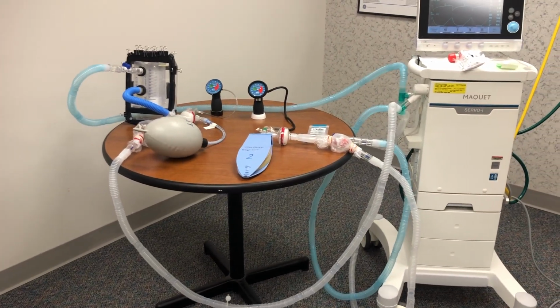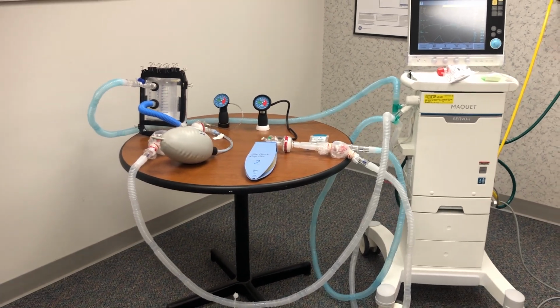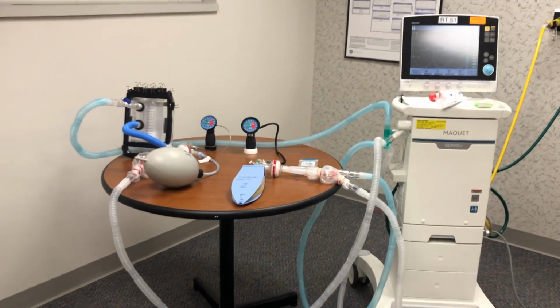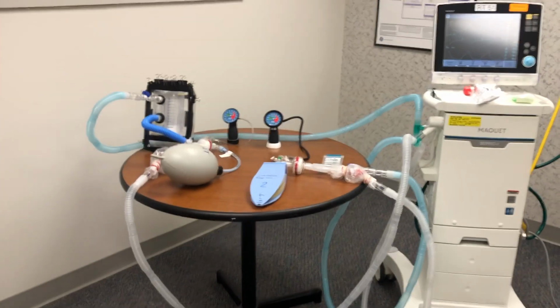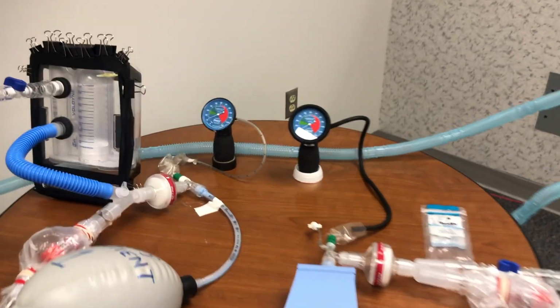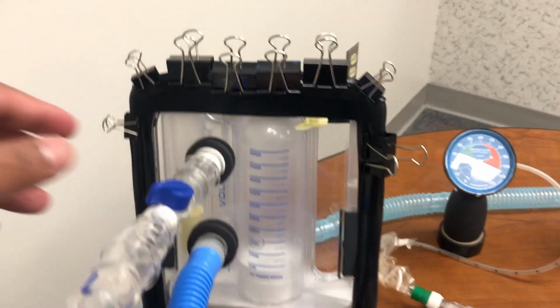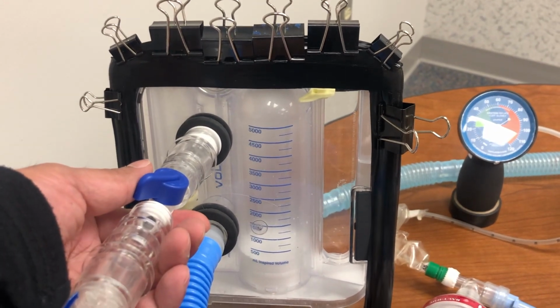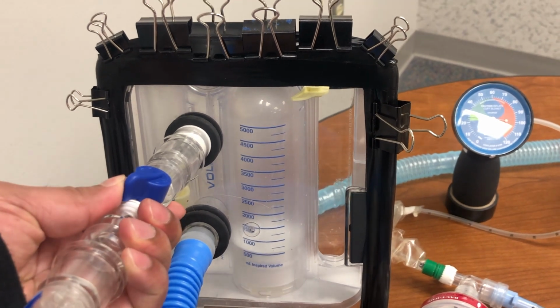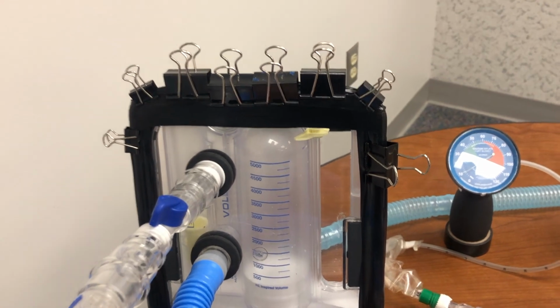Now the drawbacks of the other setups are not present, and I have tried to minimize the drawbacks in this setup, where you can control the volume or pressure. So let's see, we have already seen these settings. What I'm going to do is change this valve to control the volume to around 750. So it's at 500. I open this valve and it goes to 750 a little.